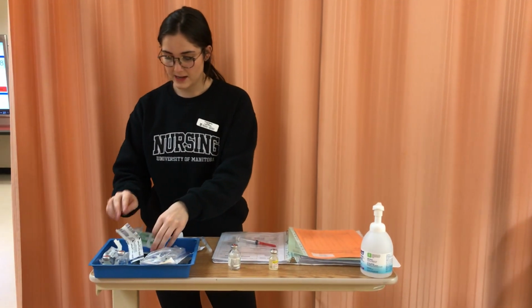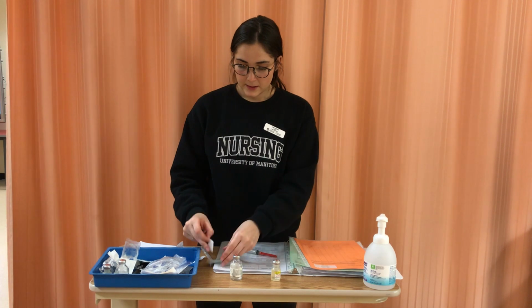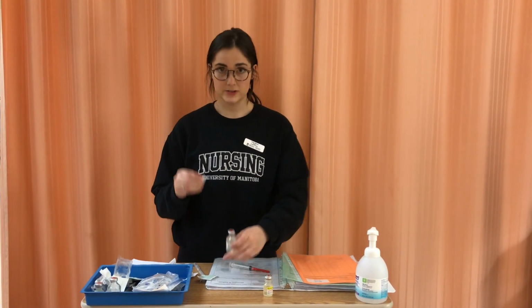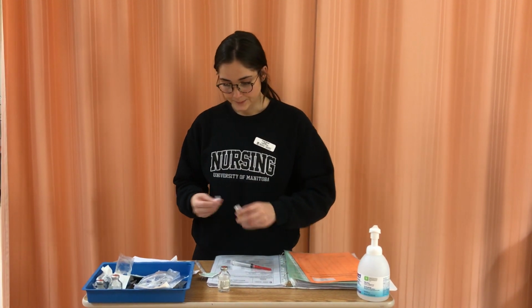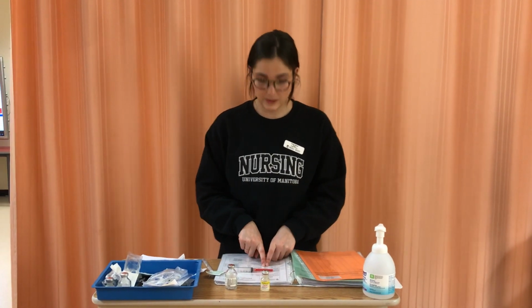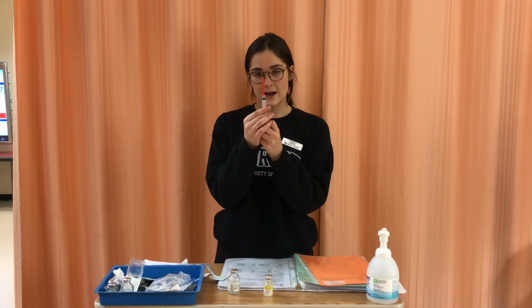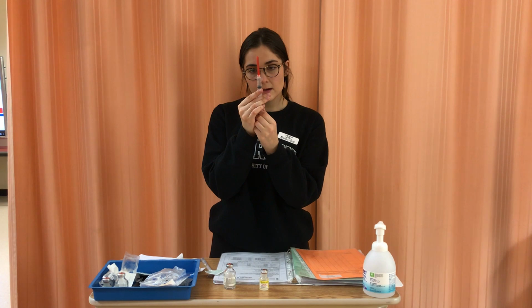So before I do anything else, I'm going to swab my medication. So in clinical, I would swab these for 30 seconds and dry for 15, and I would use a new alcohol swab, but for demo purposes, I'm just going to do this quickly. So now that those are dry, we've done the math, and we need 3.1 milliliters here of normal saline. So I'm going to grab my medication and get 3.1.